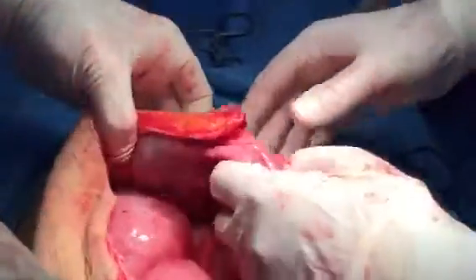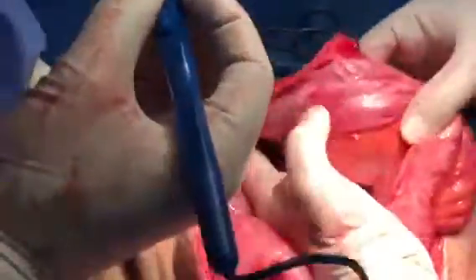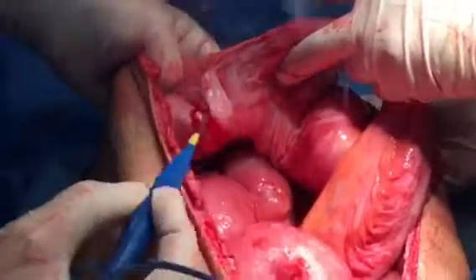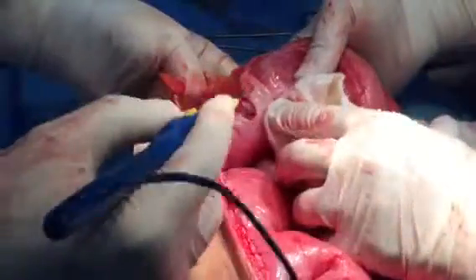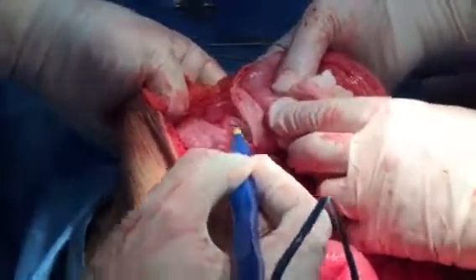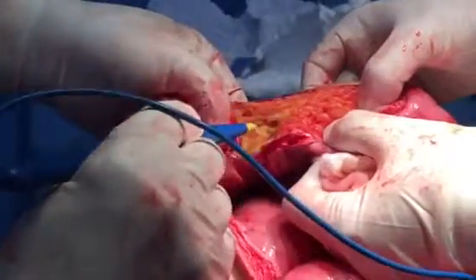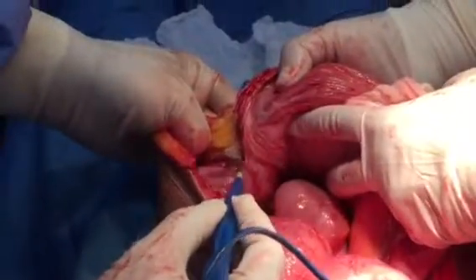This is the loop. This is the loop again. Put the pack on this, let us continue. This is the inferior epigastric, probably. Now you pass in this way — this is how to remove this adhesion.